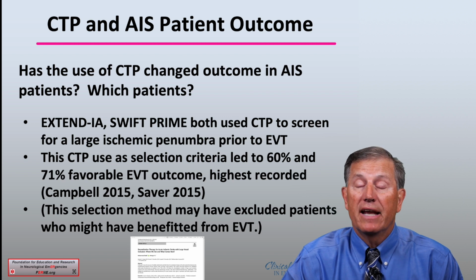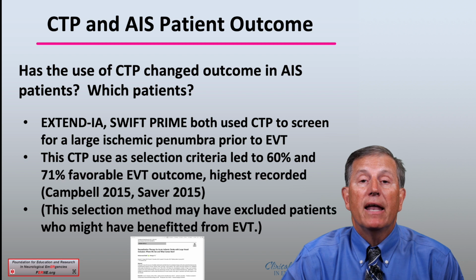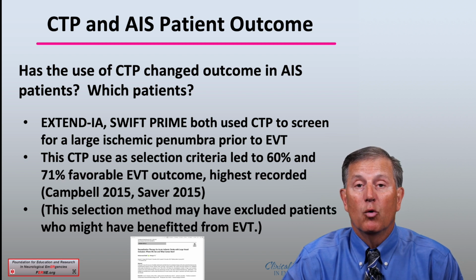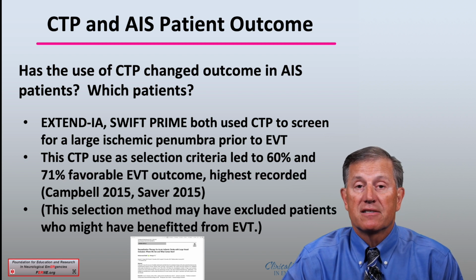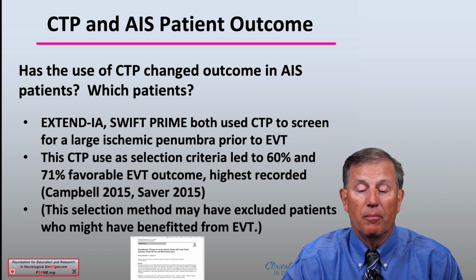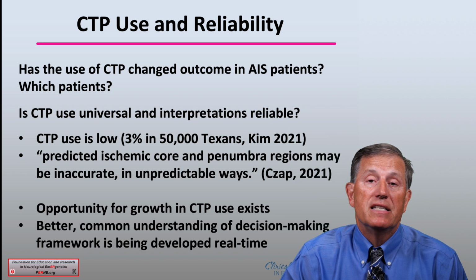We do understand, however, and this again is a potential problem, that if you use CTP to determine which patients will receive EVT, it is possible that some patients get excluded even though they might benefit from this EVT therapy. More on that later.